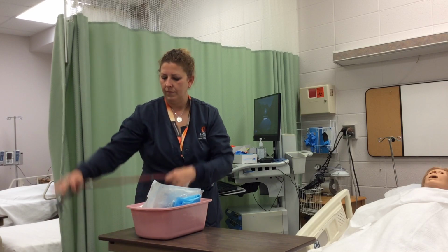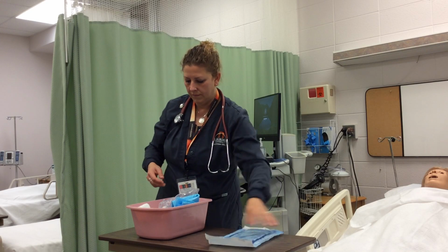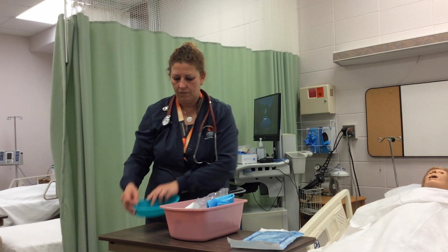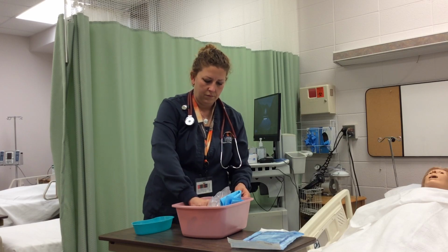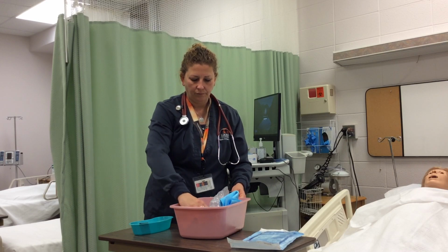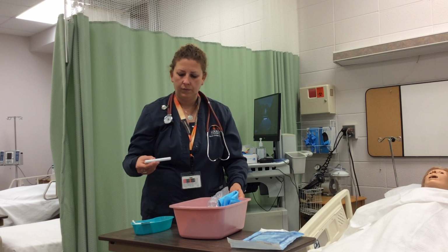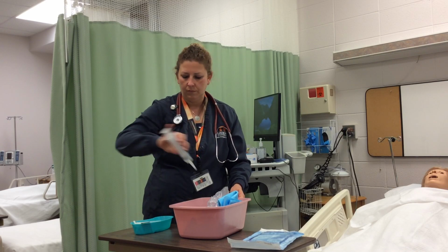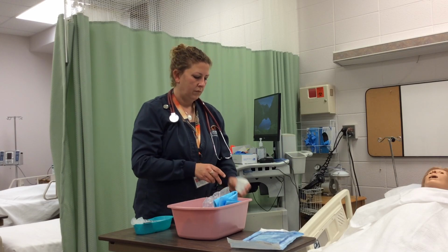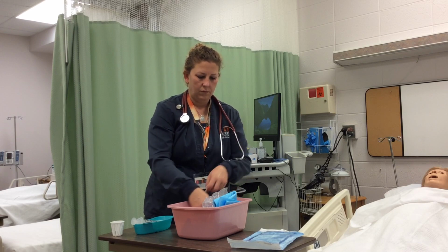To include a nasogastric tube, lubricant, clean gloves, tongue depressor, pen light, a Toomey syringe, which is a large slip tip, drinking water and cup, tube fixation device, which is optional, or tape.